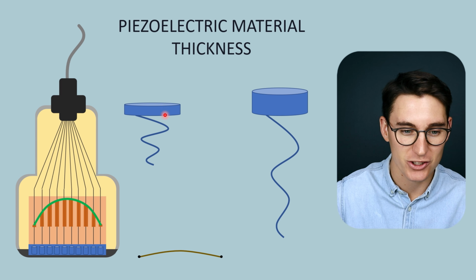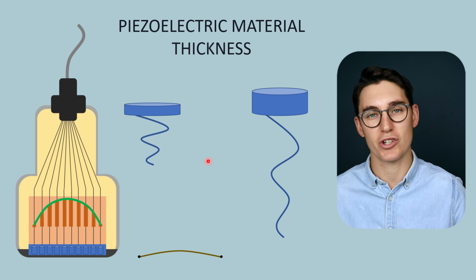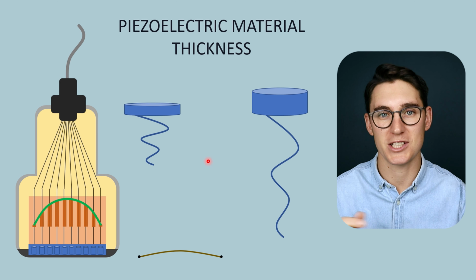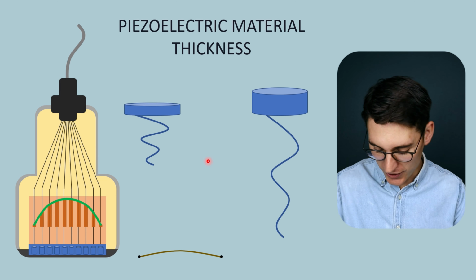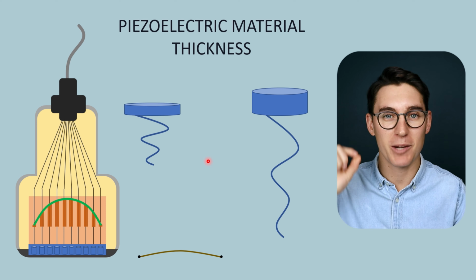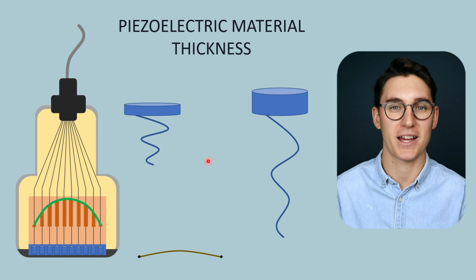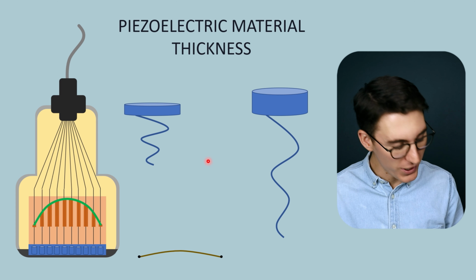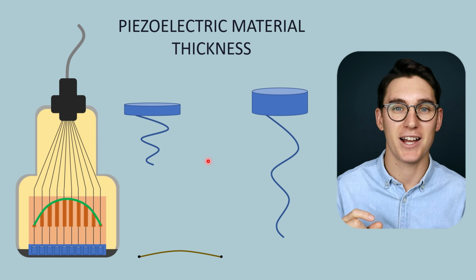Now think of these as a guitar string, the length of this being the guitar string. If we've got a guitar string going the entire length of our guitar and we strum it, we get a low frequency wave. If we were to place our finger on that guitar string, effectively shortening the length of that guitar string, and we strum it, we get a much higher pitch, a higher note, a higher frequency coming from that guitar string. So as we shorten that guitar string by compressing it closer to the fixed point at the end of our guitar string, we get a higher frequency.